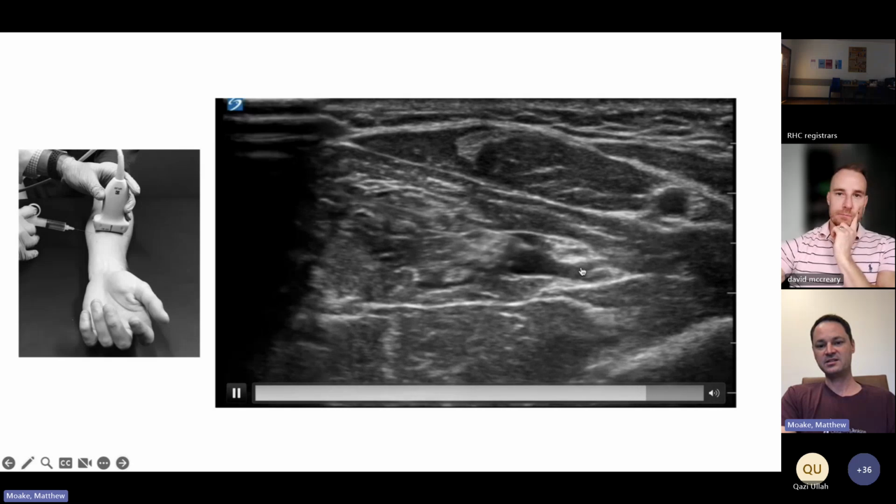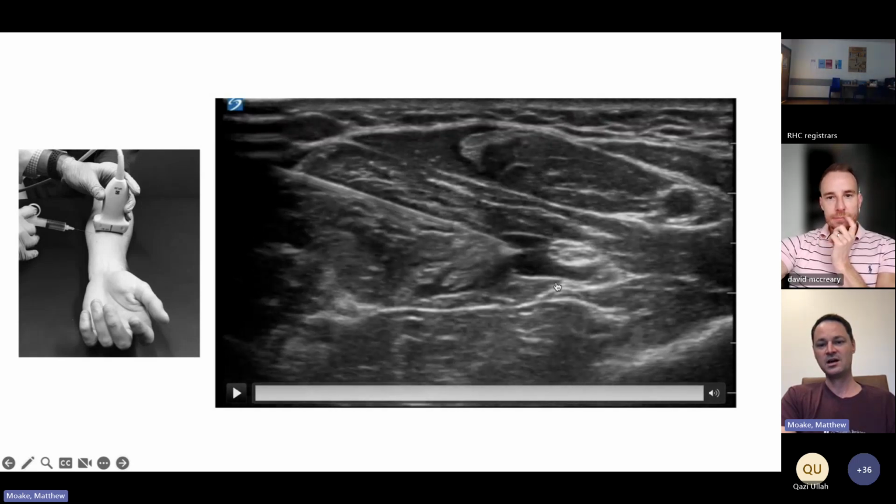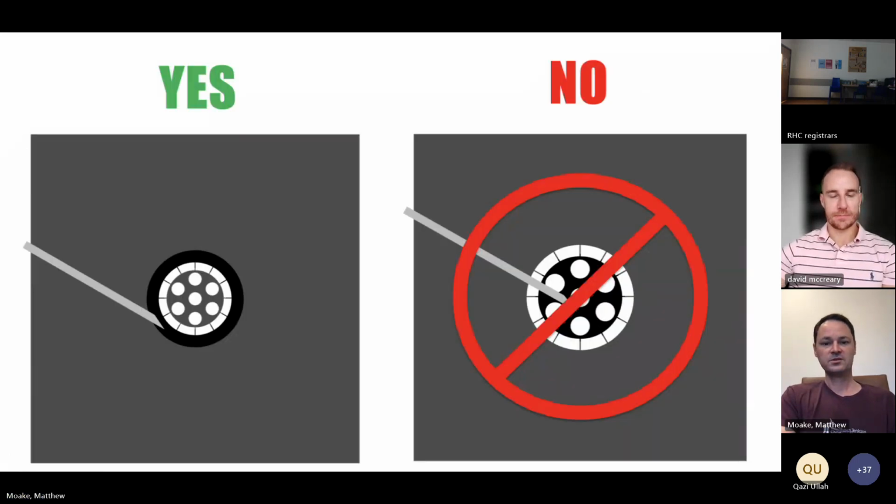And I think in the back end of this, they actually try to work themselves above the nerve to try to get like a 360 surrounding spread. I don't honestly usually bother to do that. If I've got this nice kind of 180 of anesthetic around the nerve, that's going to bathe the nerve well and give you a nice dense block. So definitely inject around the nerve, not in the nerve.